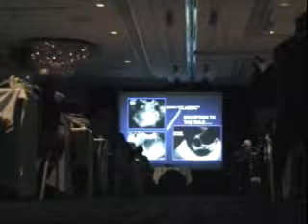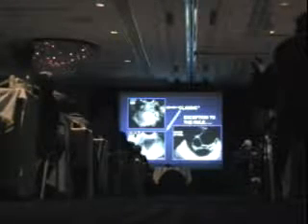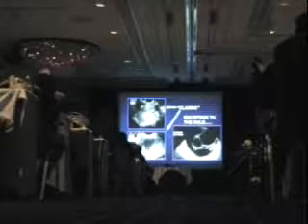Now, I'm sure you recognize this, right? What am I dealing with? Endometrioma, did I hear you say? I hope so, okay? Because this is an endometrioma that we're seeing here. This is classic. Notice, however, that sometimes with an endometrioma, the echogenicity of the blood can be very much similar to the peripheral echogenicity that we're seeing of the parenchyma.